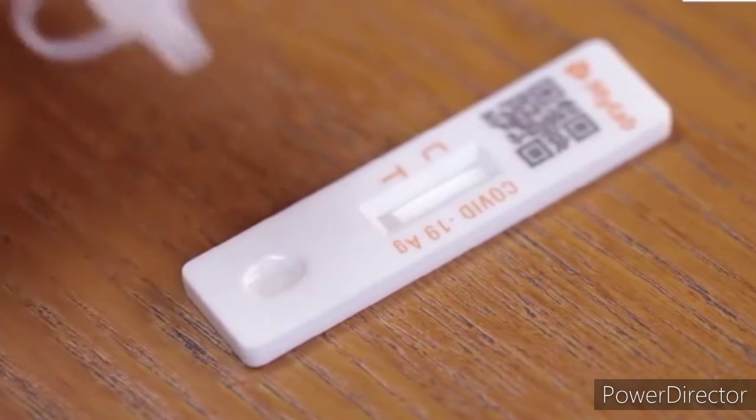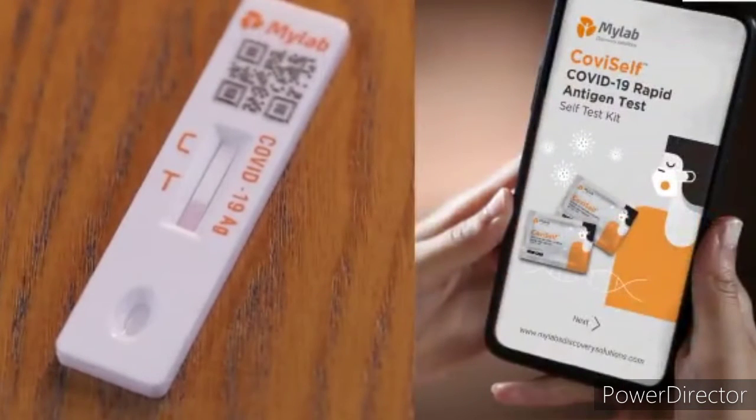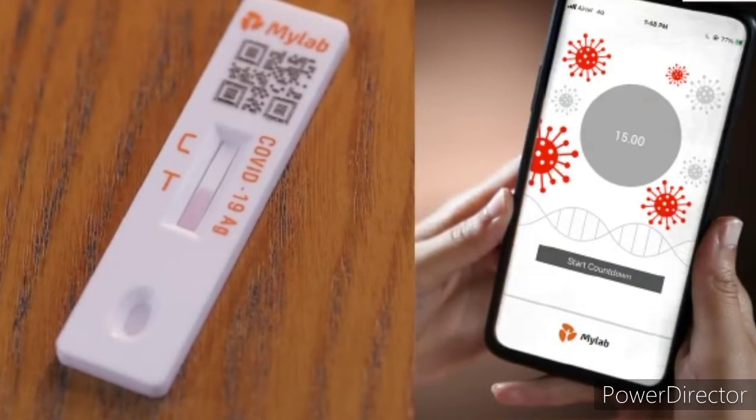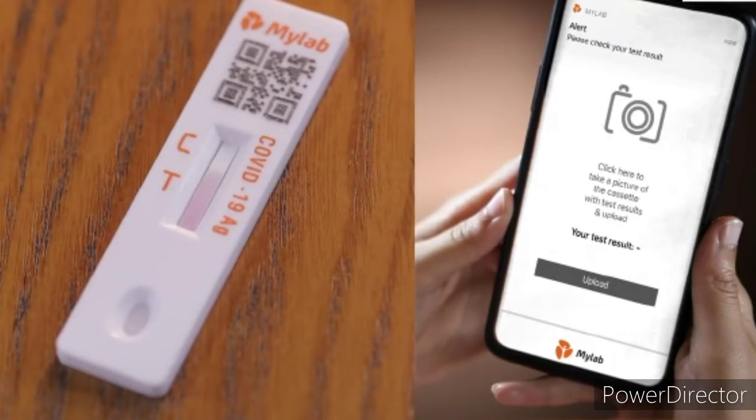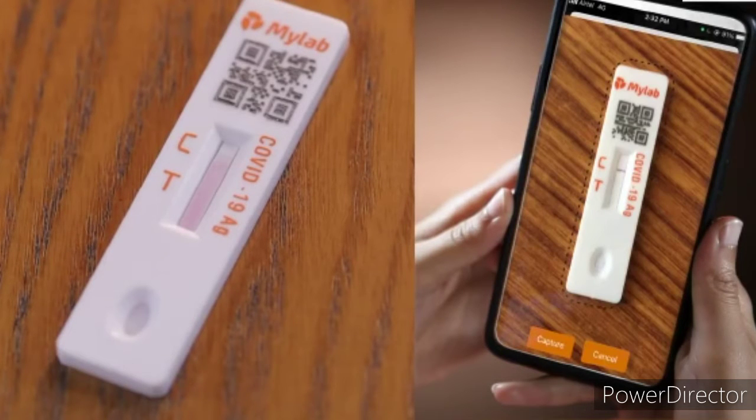Wait for 15 minutes for the results to appear. Any results appearing after 20 minutes are considered invalid. At 15 minutes, the MyLab CoviSelf app will raise an alarm. The software has an intelligently designed AI which gives accurate results.